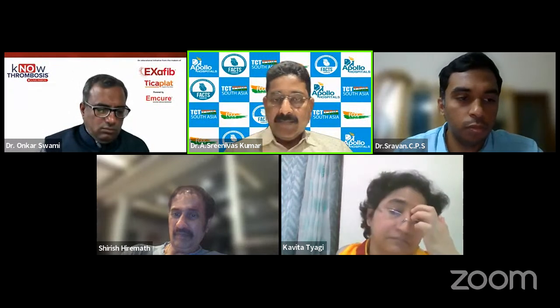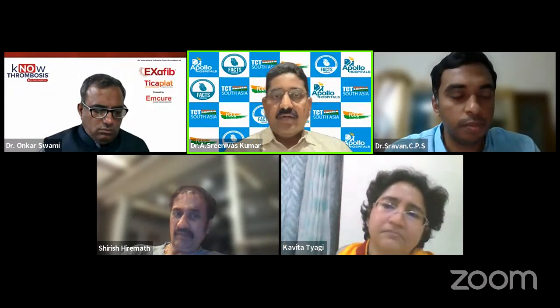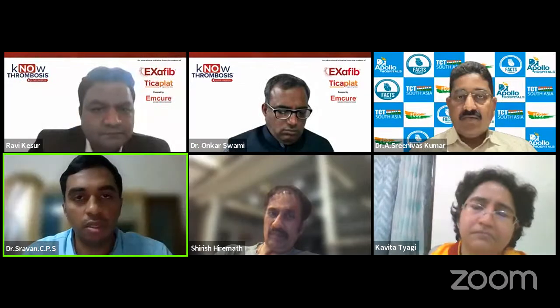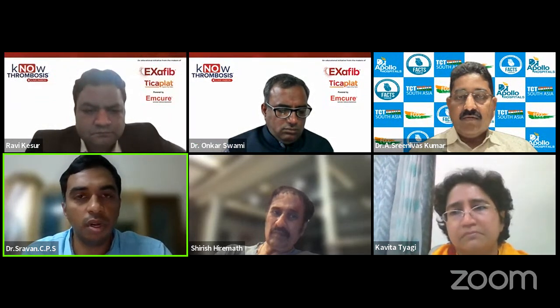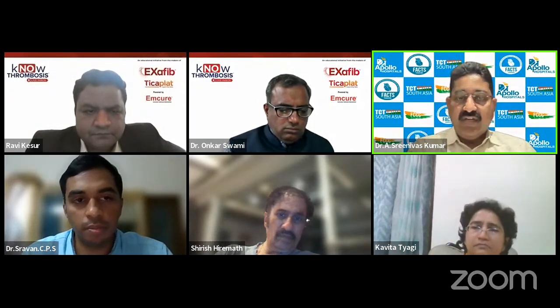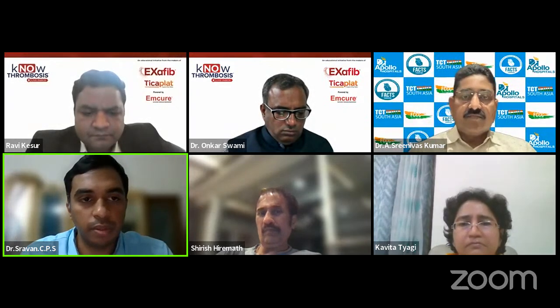Shravan, did you use IVL in peripheral anytime? Only once, sir, along with a colleague. It was a highly calcified SFA in a physician who had uncontrolled diabetes. The result was fantastic, sir. What size balloon in periphery? 5 mm is what we used for the SFA. Okay, only once. The vessel is bigger.